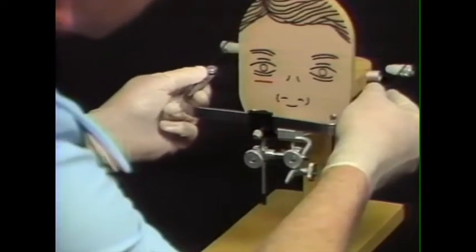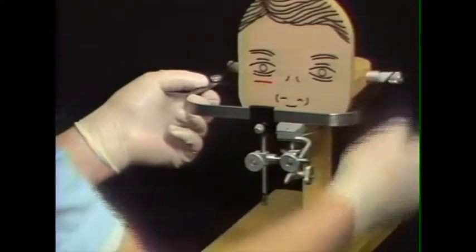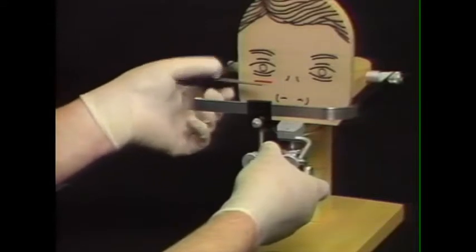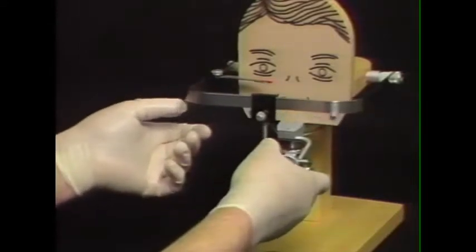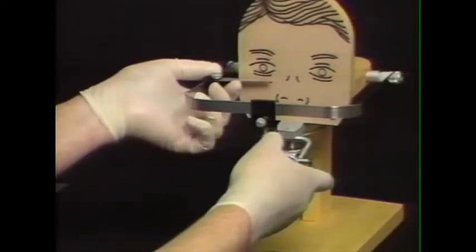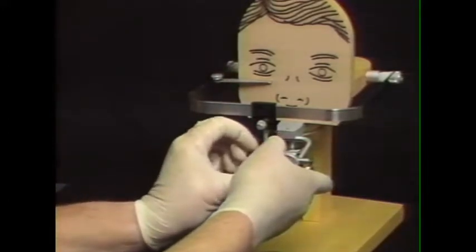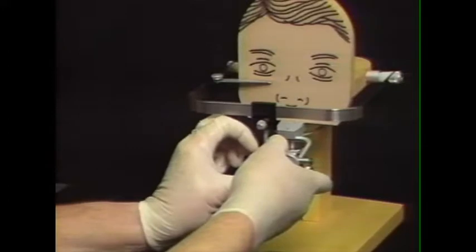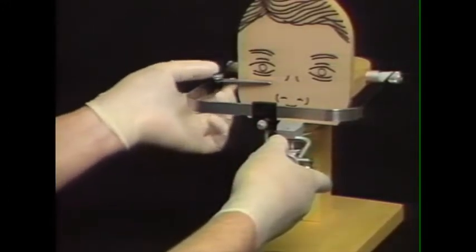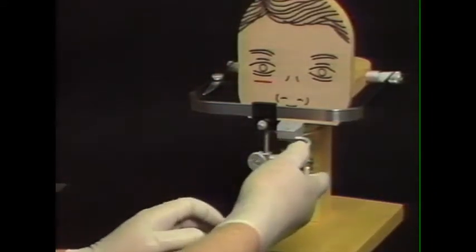and spread the face bow so that we can insert the ear rods into the ear holes, the external auditory meatus, and raise and lower the face bow until the axis orbital indicator is at the proper vertical location. We can then tighten this vertical rod clamp, number 1, to secure that relationship. We no longer need that indicator anymore because that dimension is set.